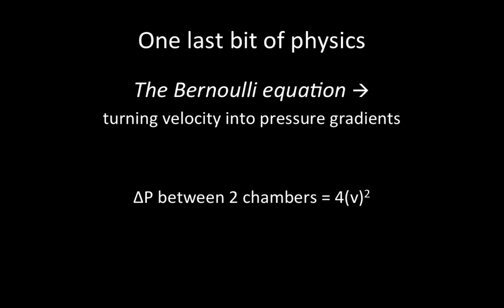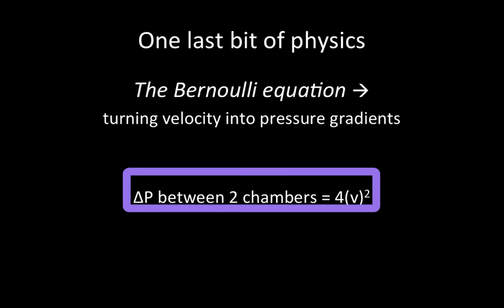Finally, one last bit of physics, the Bernoulli equation. So the Bernoulli principle, again, is probably familiar from high school physics, can be simplified to the equation below, and this allows us to use a measured velocity to calculate the pressure gradient between two chambers.